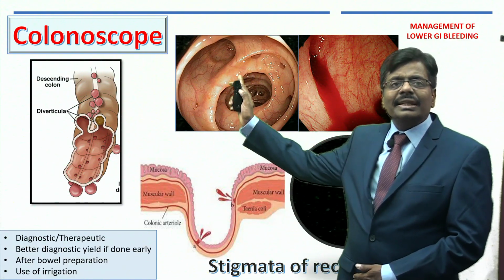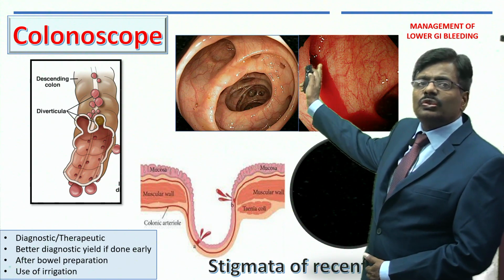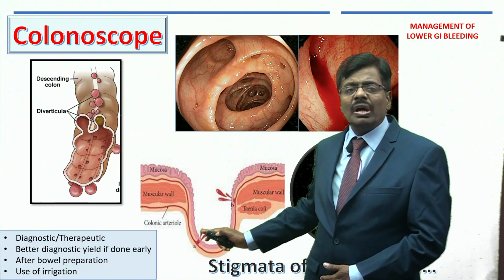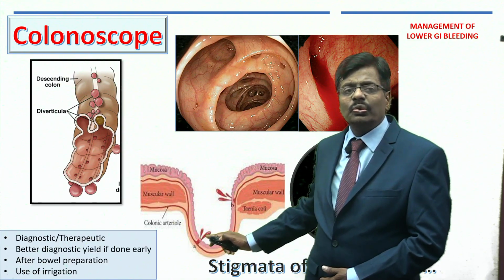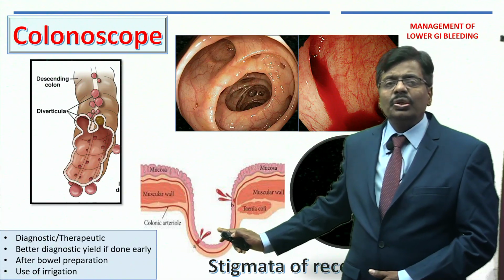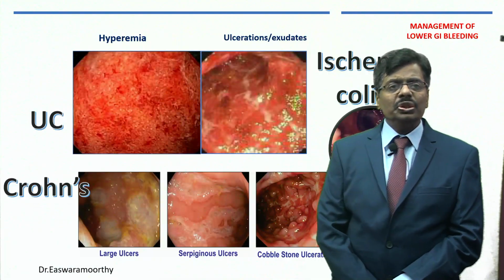And classical diverticular disease, as you can see like this, there could be a bleeding from a small vessel like this, deep inside the diverticula. As we all know, it has only the mucosa and the serosa; it lacks the muscle. So, you should be very careful not to use any diathermy. Very often we use something like hemoclips in these situations.